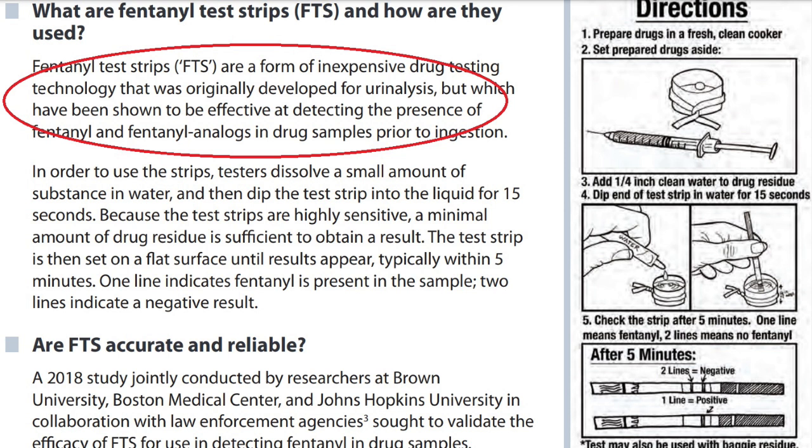The commercial products appear to be quite sensitive, but not terribly reliable for telling you much beyond that fentanyl is present in the sample. I could not find any results for the common reagent test we've talked about for fentanyl, but this may be because fentanyl is so potent that it'll be cut with so much other crap that its effective concentration is too low to be reliably detected using these simple reagent tests. So you're stuck with the commercial products, I'm afraid.